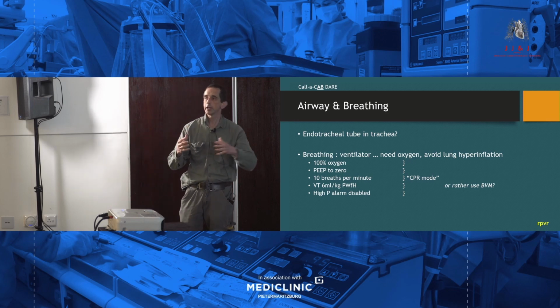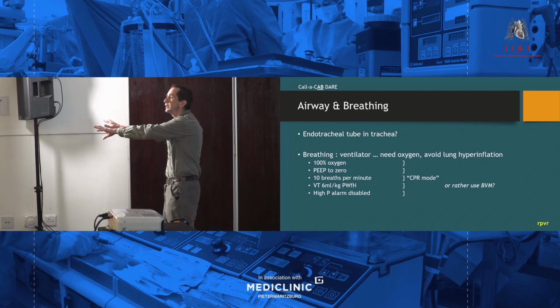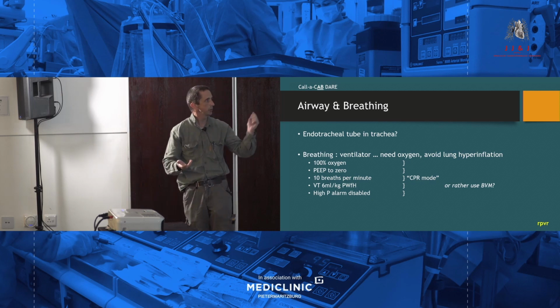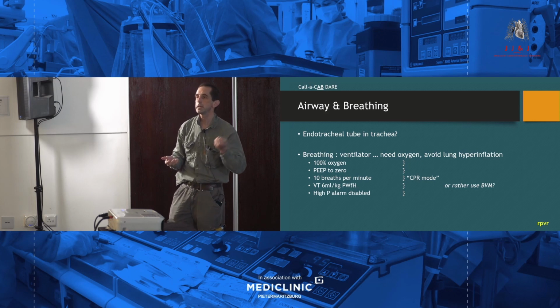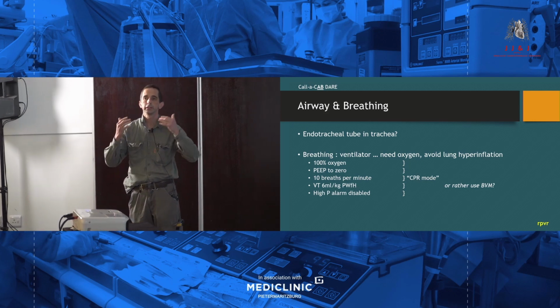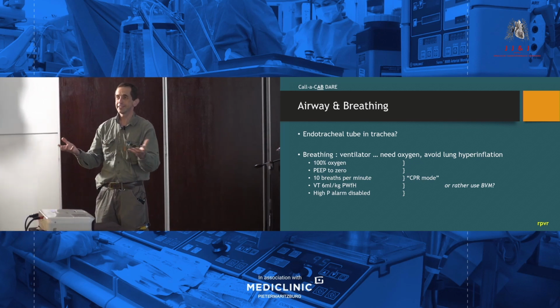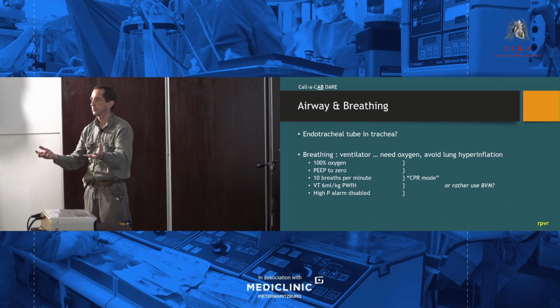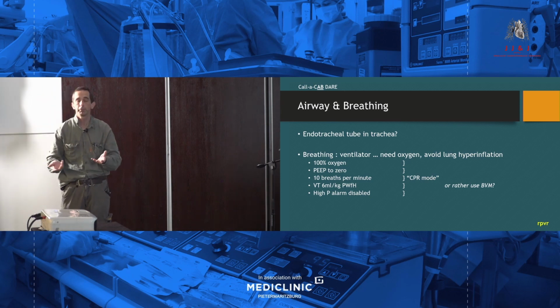So, straight away, patient has an arrest. If they're on a ventilator, even if it's not doing very much, because we're doing lung protective ventilation on this guy with shot lungs, put it on 100% oxygen. Immediately drop your PEEP to zero. You cannot have retained air in the chest in a zero cardiac output state. Now, if you're thinking, well, my guy's got terrible lungs, if I drop the PEEP, I'm going to lose all my recruitment. Yeah, that's the problem. It's a disaster, but you've got to do it. Otherwise, the heart's not going to pump against the air.